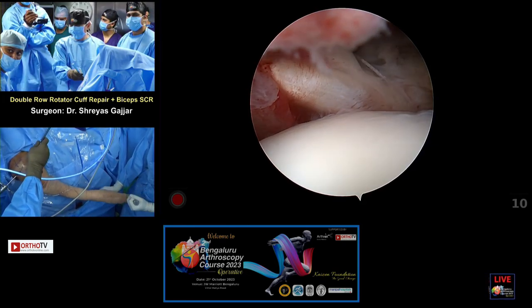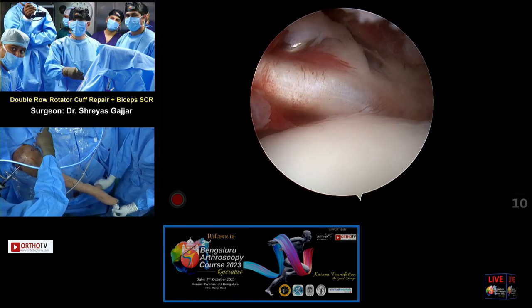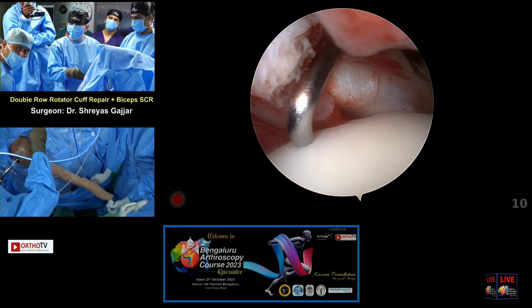So you see here, she's got her full external rotation as before. So we've not gone too tight. So this completes the subscap repair part. Can you straighten it, Rohit?